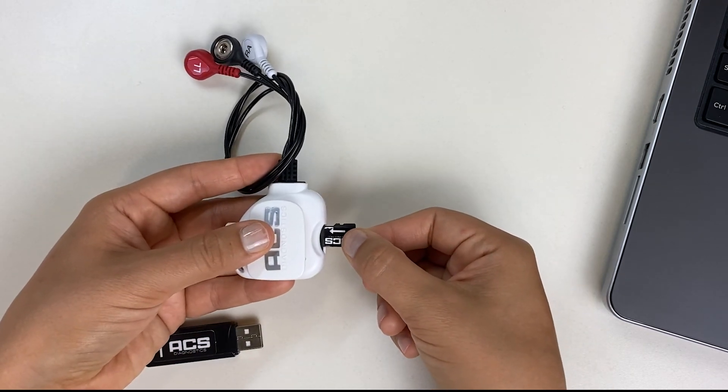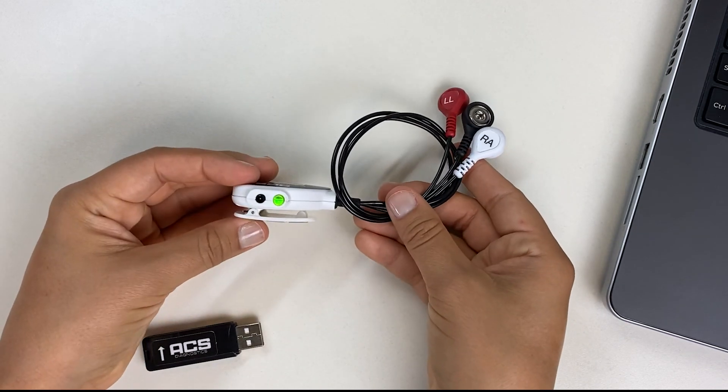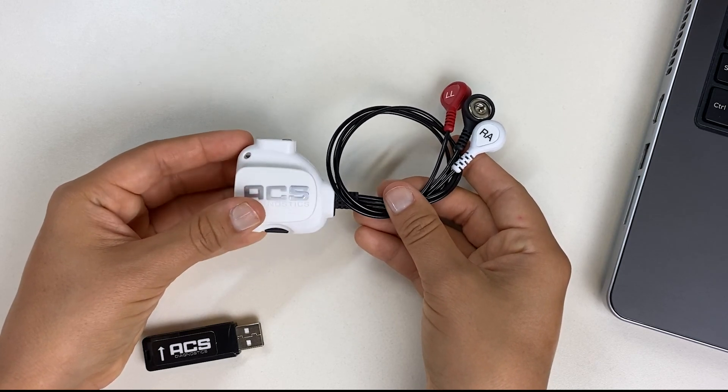When you hear the card click, the recording has started. Verify a solid green light on the clip. During the recording, the green light will flash one time every 10 seconds. The clip will automatically turn off after 24 hours.